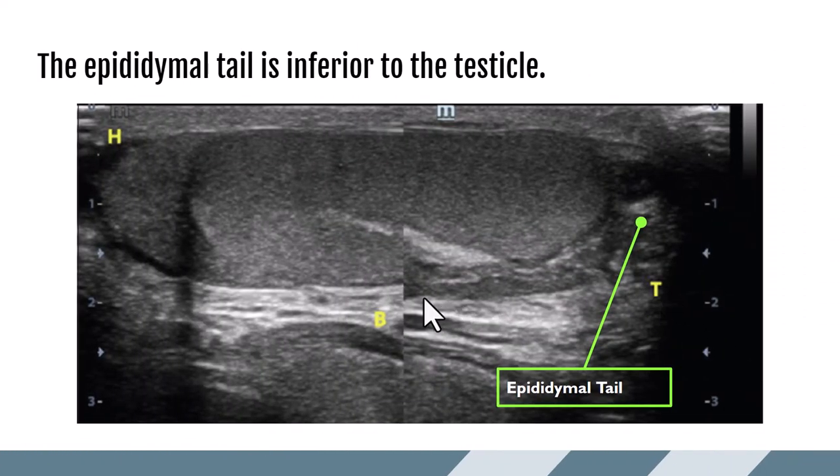Continuing on with the epididymis, we can see the epididymal body coming down into the tail, which sits at the inferior pole of the testicle. Sometimes the tail is very prominent, especially with infection, and sometimes not quite as prominent.